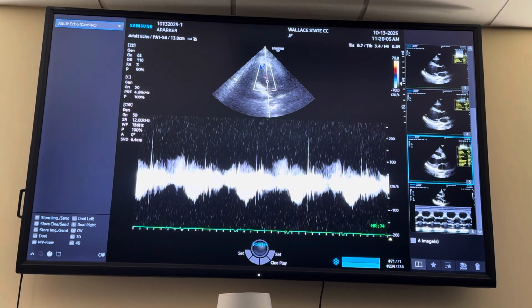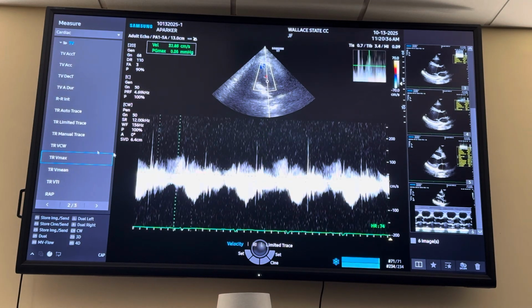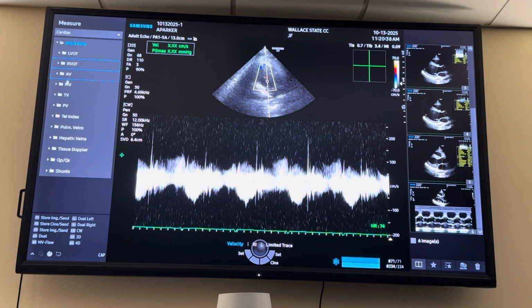So here, the pulmonic valve is opening, sending blood flow away from you, going towards the lungs. This is during systole, the pulmonic valve is open. So here the pulmonic valve closes. This is during diastole. If you have a significant pulmonic insufficiency jet, you will be able to see a slope, but I would say about 90% of the time, so more likely than not, you're just going to get this in diastole. So think of where you are at your QRS. You're in diastole.